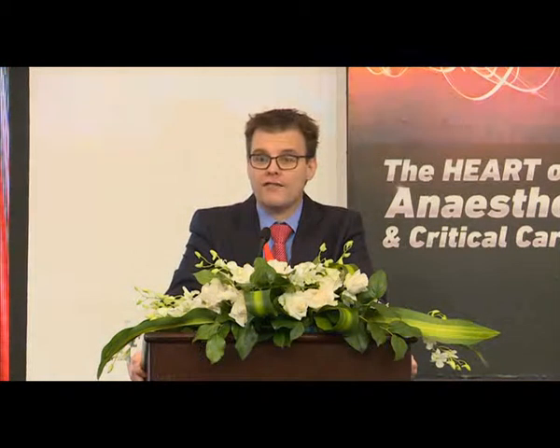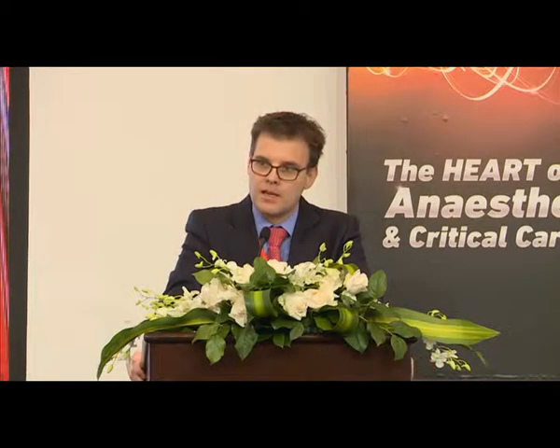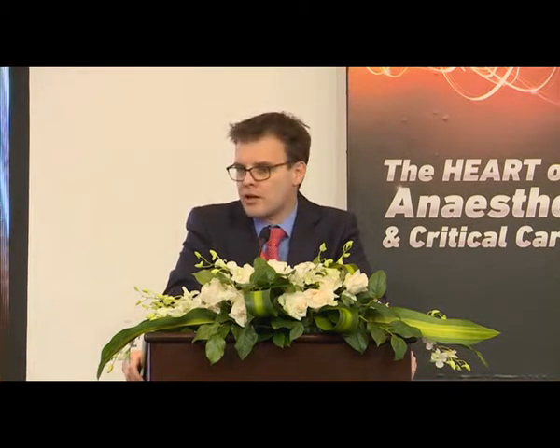So for us, we have intensivists cannulate. We have perfusionists there at the onset of ECMO. So the perfusionists prime the pump, they're there for commencement, they're there for mobilization of patients, etc. But the nurses run the pumps on their own, minute to minute, with oversight from the intensive care consultant. But the nurses do it all.